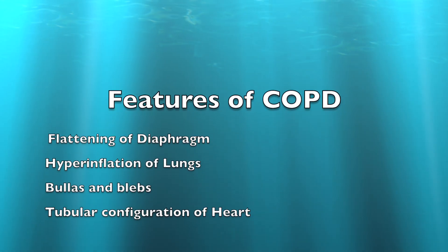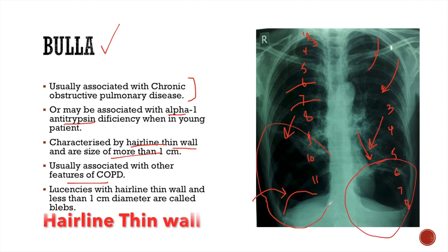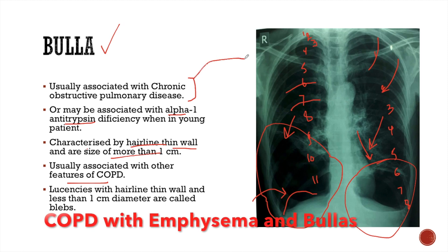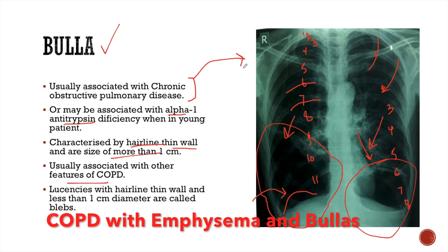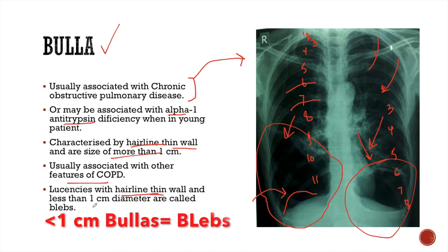These are all features of chronic obstructive pulmonary disease. In this X-ray, we can also see lucent areas in both lower zones, and both these lucent areas have hairline thin walls — so these are pulmonary bullas. This patient has chronic obstructive pulmonary disease with emphysematous lungs and multiple bullas. When similar lucent areas with hairline thin walls are sized less than 1 cm, they are known as blebs.